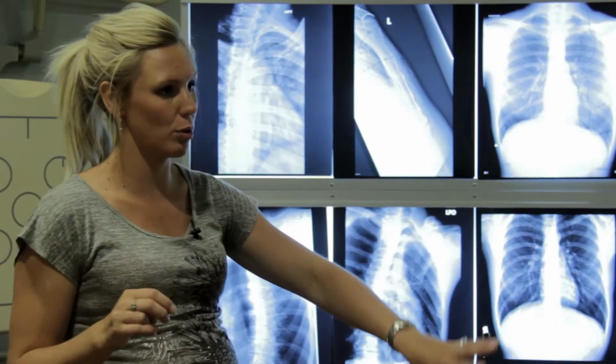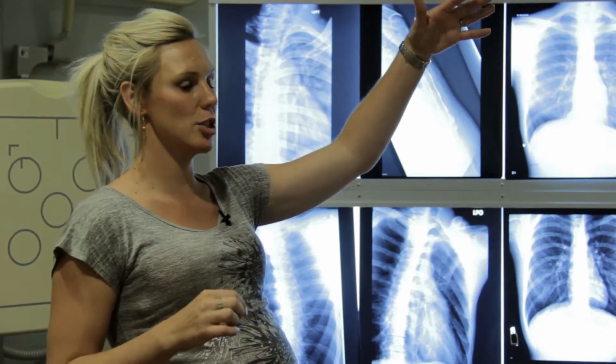Now, the fourth rule we had with upright was 72 inches. Most tables we won't be able to get 72 inches. So what do? High as you can. Yep. In room 1 and room 2 or any kind of floor room where you can't lower the table, go as high as you can. It's going to be about 46 inches.